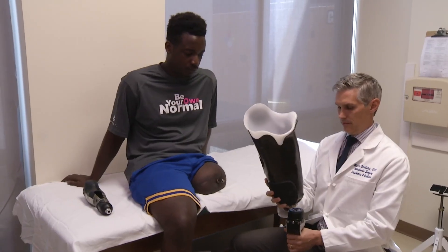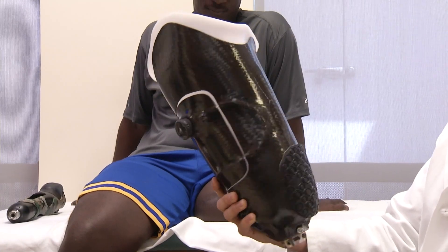I'd say it's amazing. I used to use the socket prosthetic. I couldn't sit in it for a long time. It would just pop off.